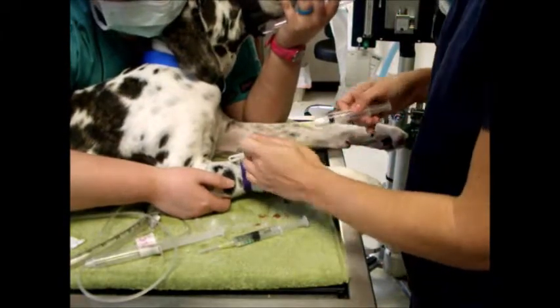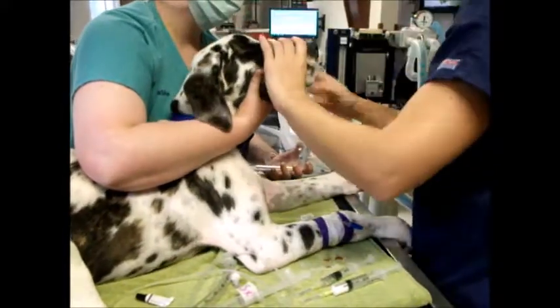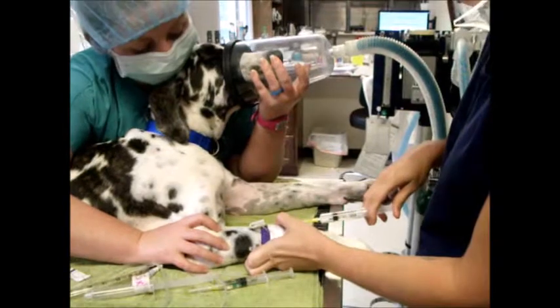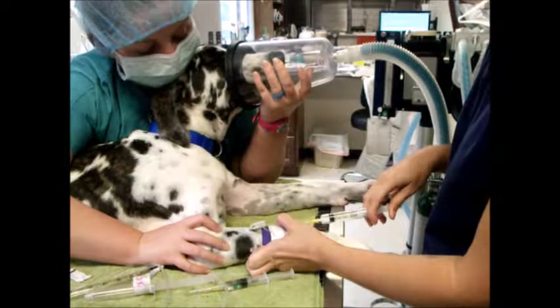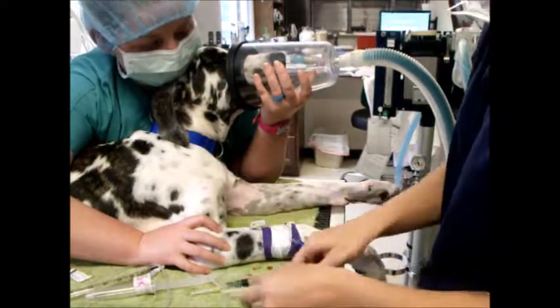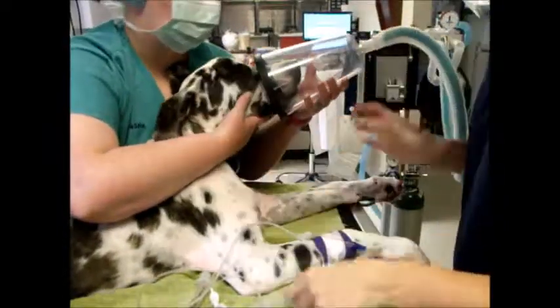Now we're going to check her jaw tone real quick — she's ready. She's definitely going to need some more. We'll put her oxygen back on. We'll give about another fourth of this and check again. She's still got a pretty good jaw tone, so we'll go ahead and give the rest.